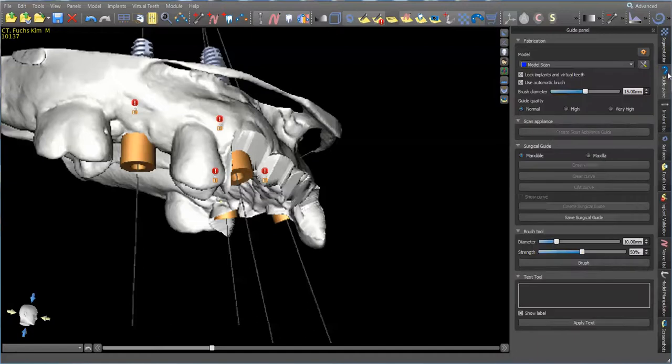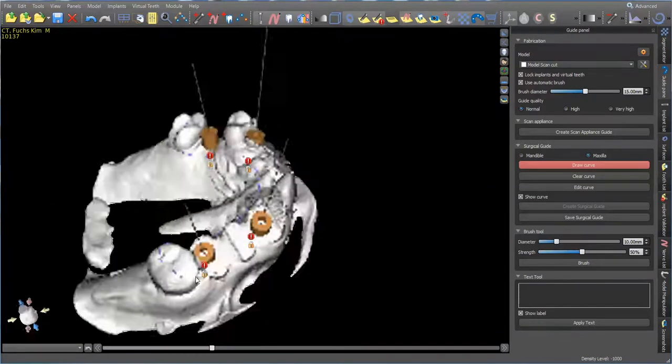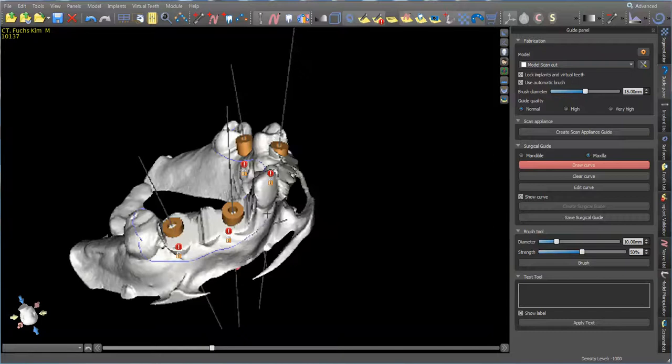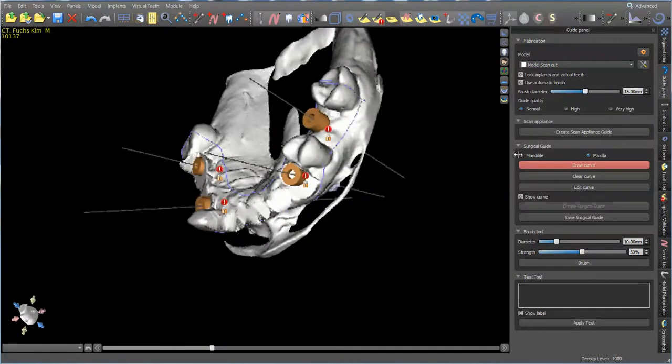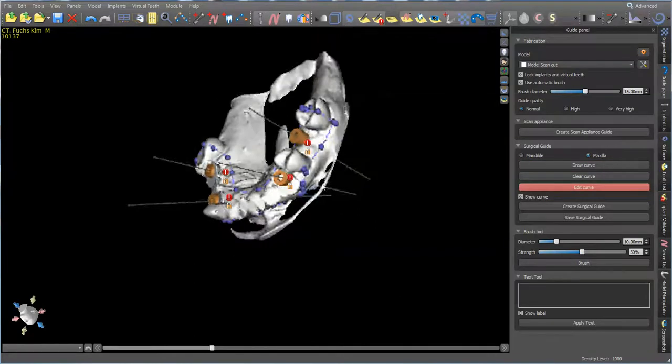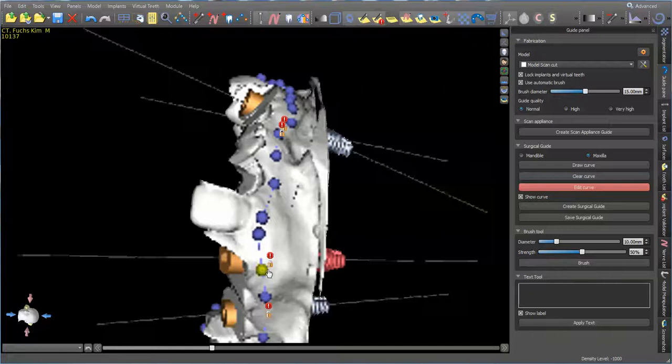So I'm going to go into guide panel, make sure I'm on the model cut, and I'm going to draw for the maxilla, holding the shift key down. Alright, let's edit that, make sure it looks good. Bring all this up. And now it looks like it's ready.